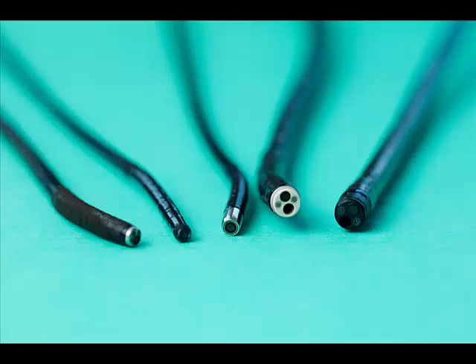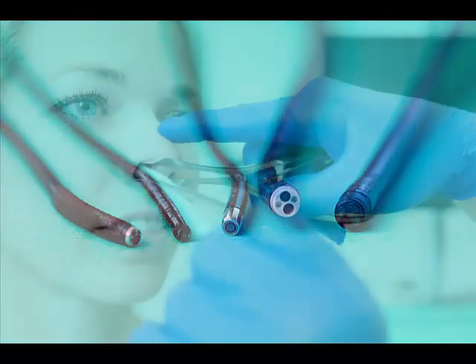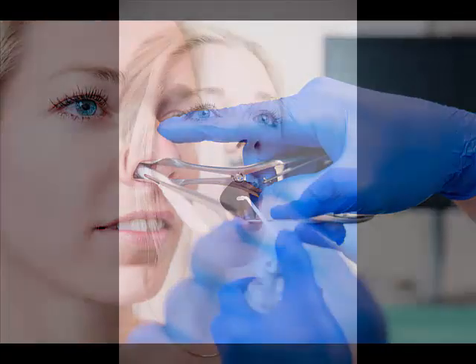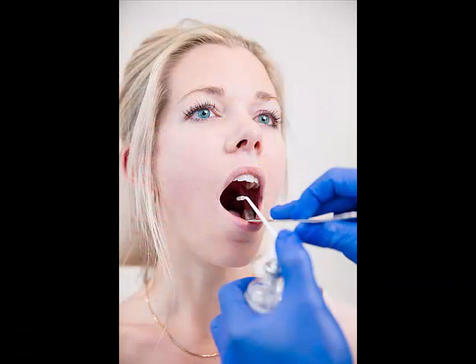With the introduction of distal chip endoscopes, lesions in the pharynx and larynx can be better visualized. For an adequate examination, patient instructions and sometimes local anesthesia are the key to a successful procedure. When needed, cotton patches with local anesthesia and a decongestant can be helpful. An anesthetic spray can be used to anesthetize the pharynx by letting the patient deeply inhale.